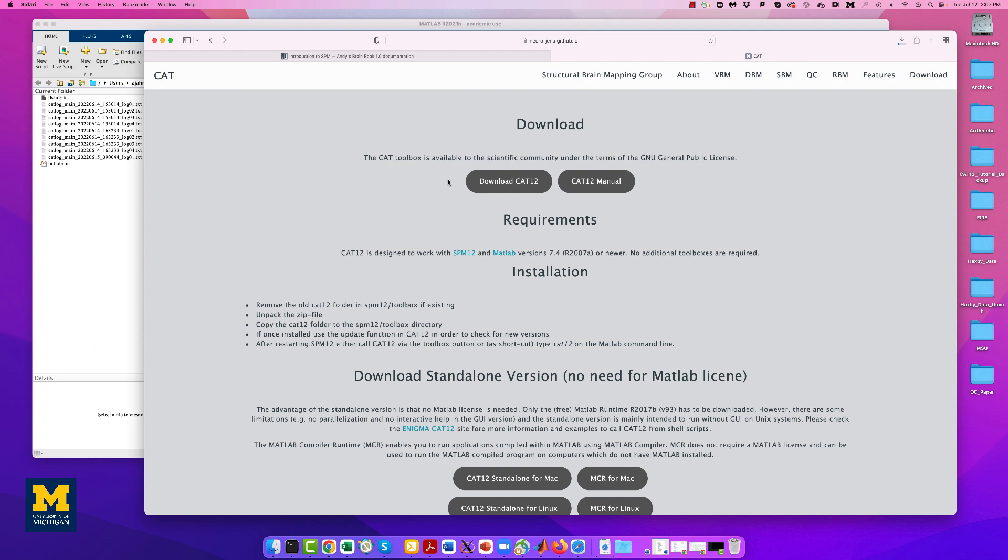I also want to mention here that I've been having issues lately using Chrome to download the CAT-12 toolbox, and here I am instead using the Safari browser. I'll come back in a few moments when the package is finished downloading.